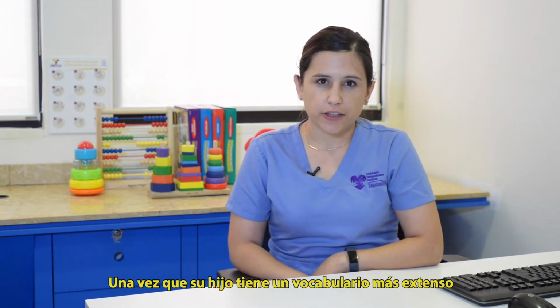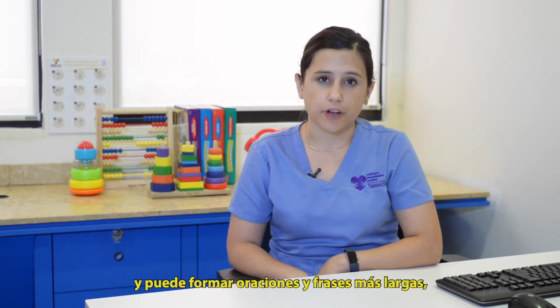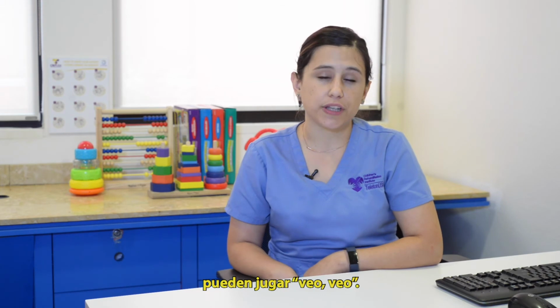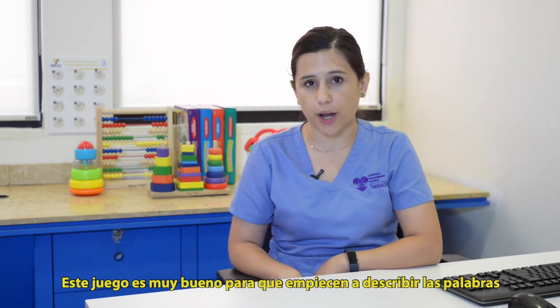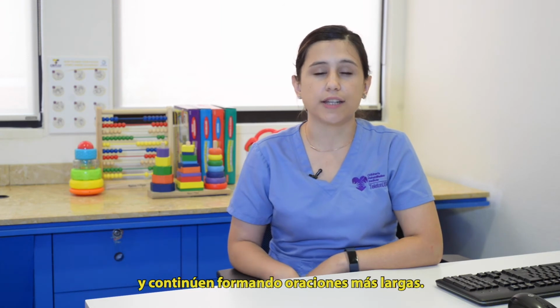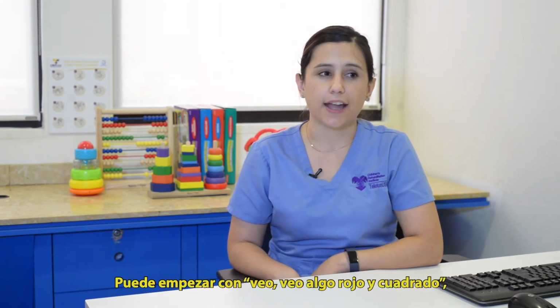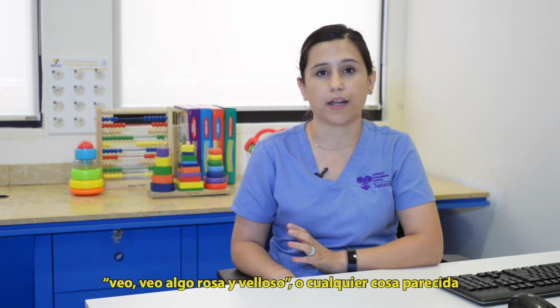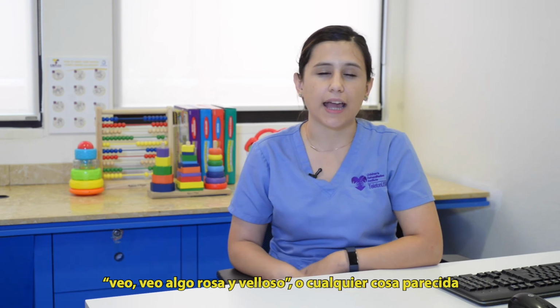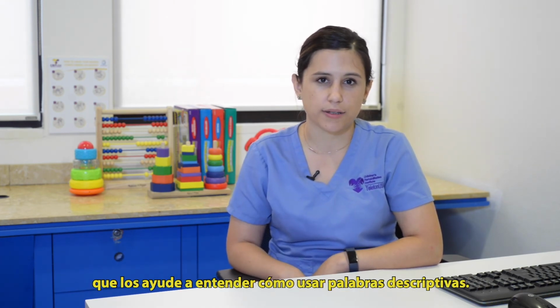Again, once your child has access to more vocabulary where they can formulate longer utterances and phrases, using I Spy is a really good game to get them to use more describing words and continue to build longer utterances. So you can start with I spy and using words like I spy something red and square, I spy something pink and fuzzy, anything like that to get them to understand how to use their describing words.